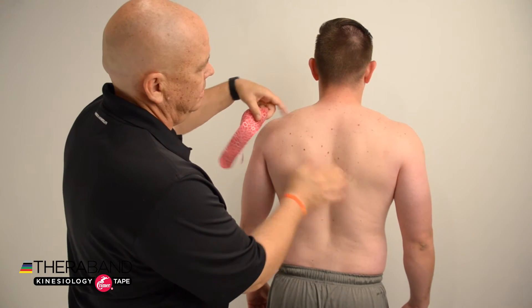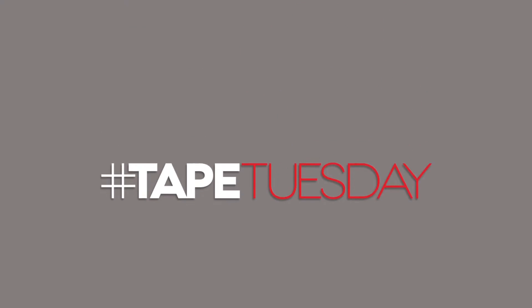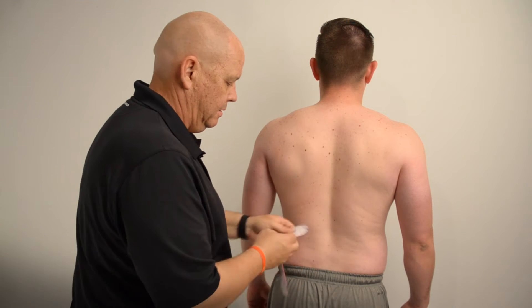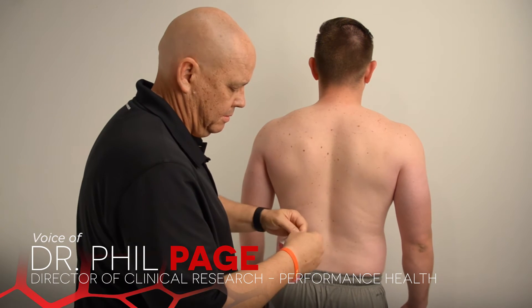For our postural support taping, we're going to begin with two I-strips. I'm going to break the backing at about two to four centimeters on each end of the tape strip.